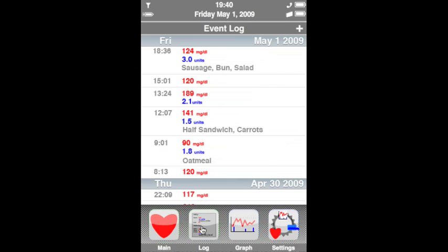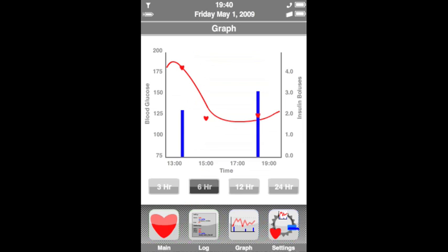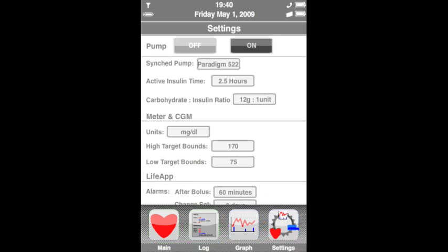The event log stores and displays all of the user's blood glucose levels, boluses, meals, and other entries. The graph tab, particularly useful for those with continuous glucose monitors, displays the user's combined blood glucose and insulin dosage history. The settings tab allows for adjustment of the normal pump and meter settings and customization of the interface.